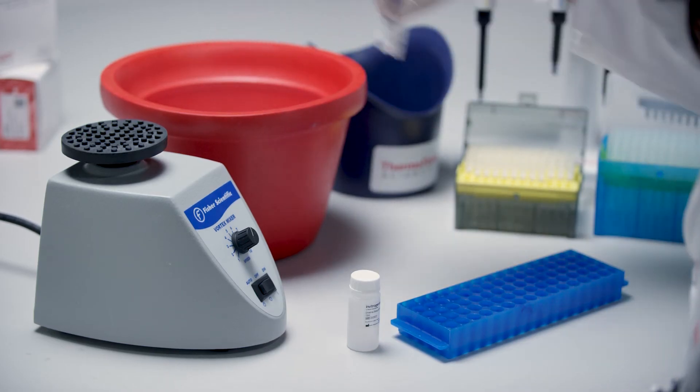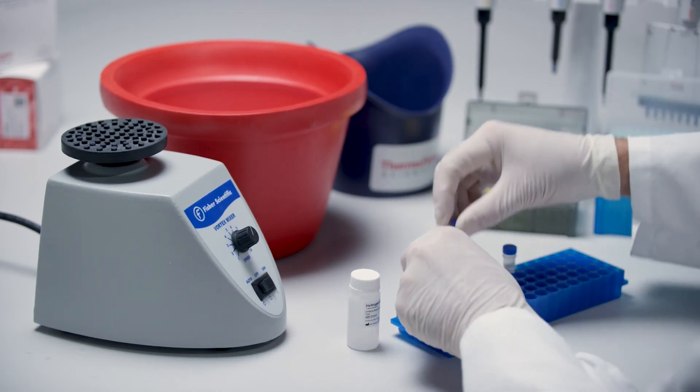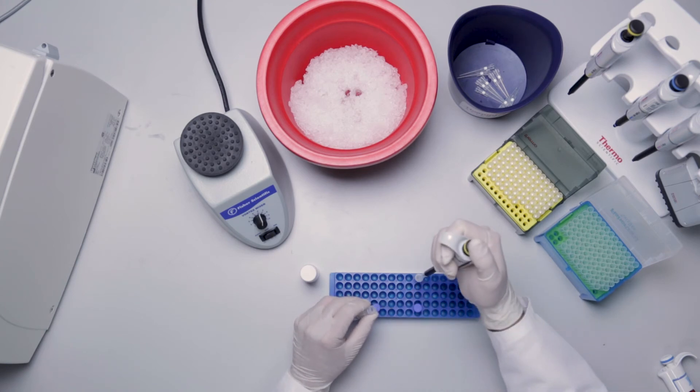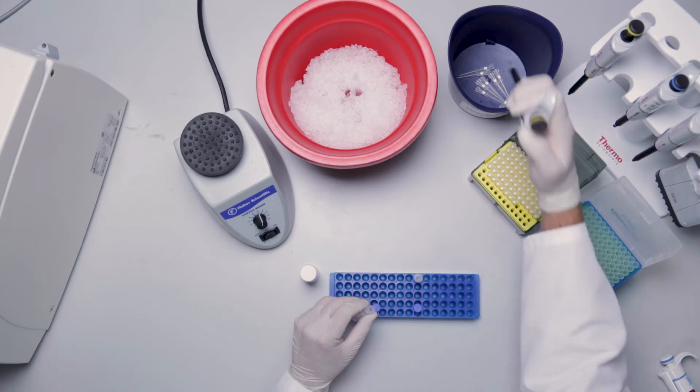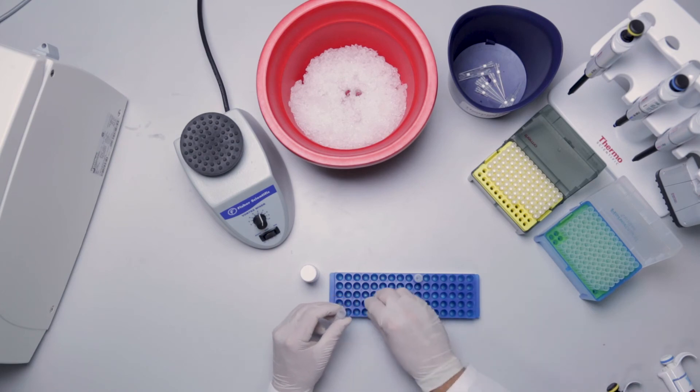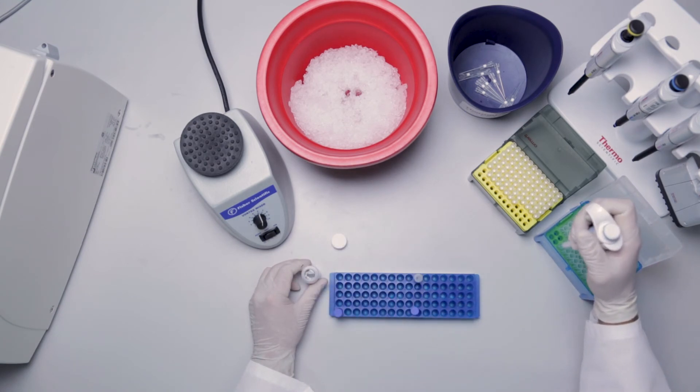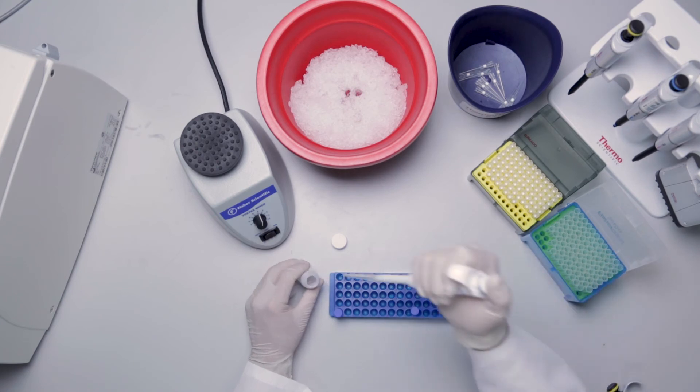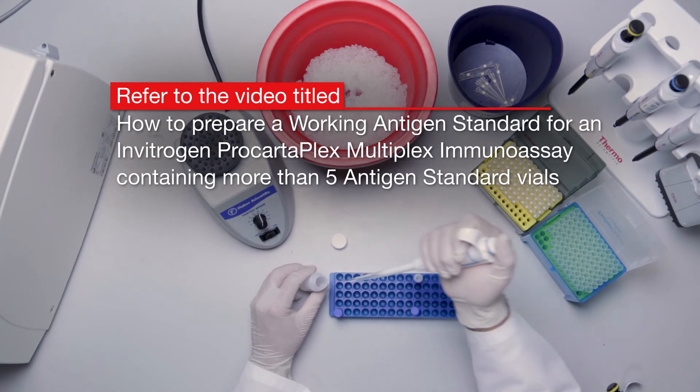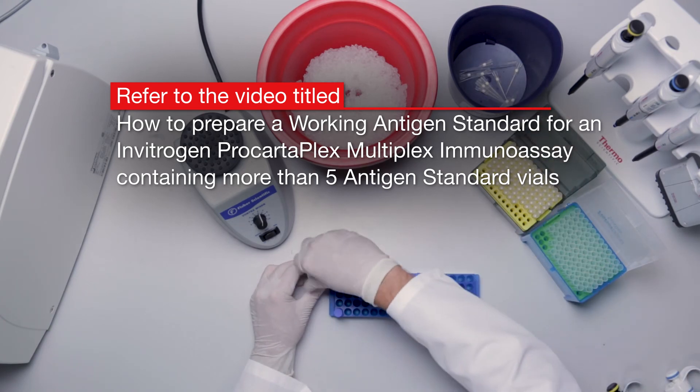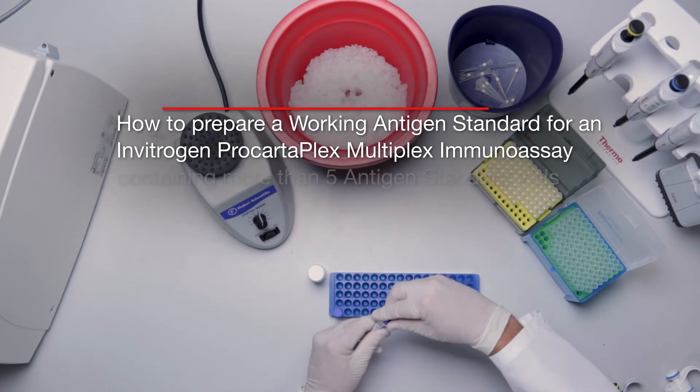Pool the entire contents of each vial into one of the vials and fill with sample type specific buffer to a total volume of 250 microliters. Pooling of antigen standard vials to prepare the working antigen standard must never exceed 250 microliters. For details on how to pool more than five antigen standard vials while not exceeding 250 microliters, refer to the video titled how to prepare a working antigen standard for an Invitrogen ProCartaPlex multiplex immunoassay containing more than five antigen standard vials.